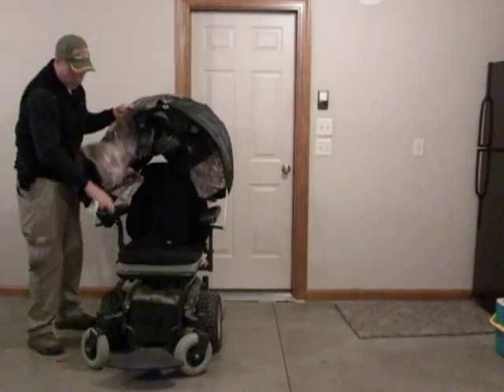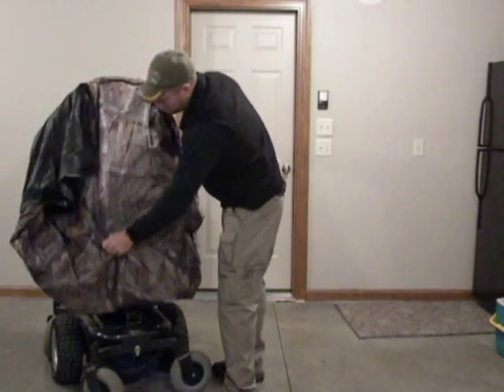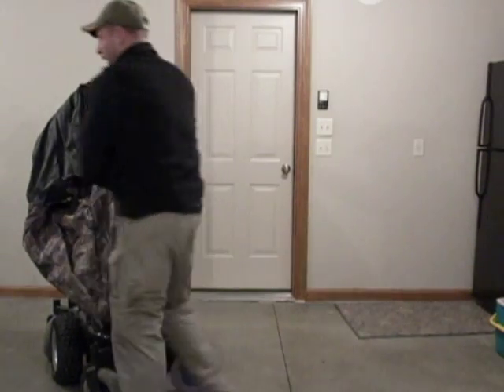Then we'll swing this chair back around so you can see the back side. On the back side of the blind, I went ahead and melted and reinforced the holes where the handle went on.